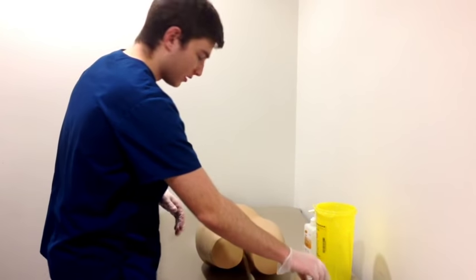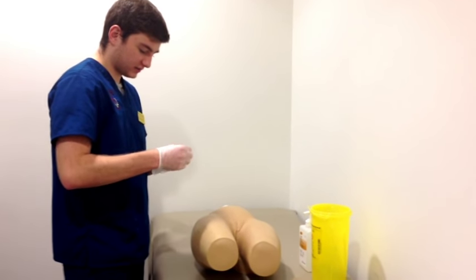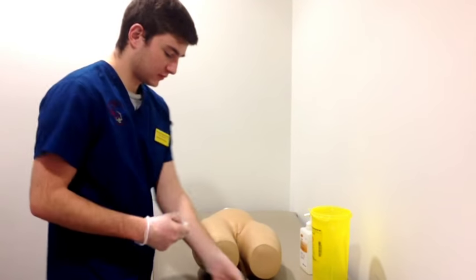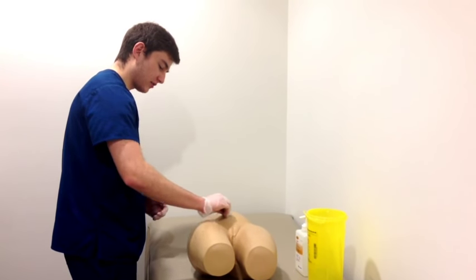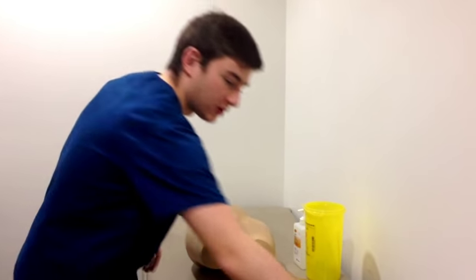Alright, so I pick my area here. I'm just going to then sanitize the area with an alcohol swab, and circle the area around 2 inches in diameter, circling out from inside to out. I'm going to dispose the alcohol swab. I'm going to grab my needle.